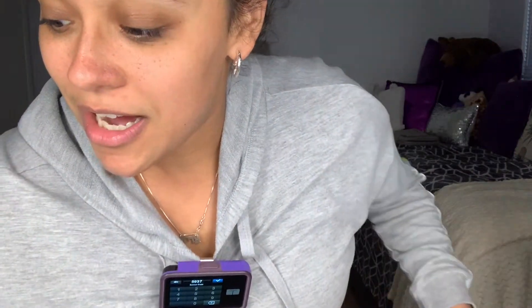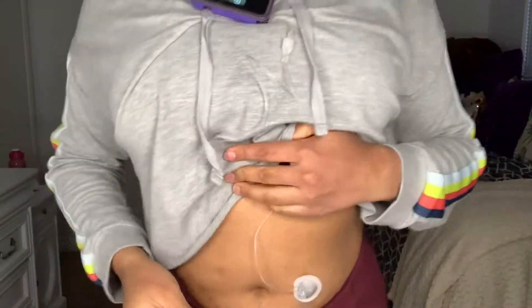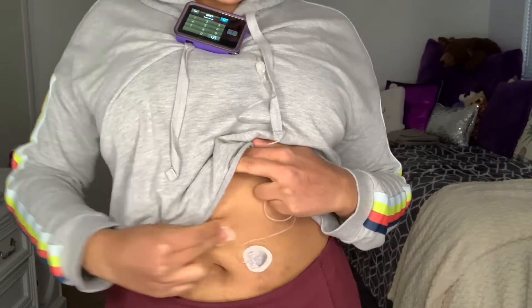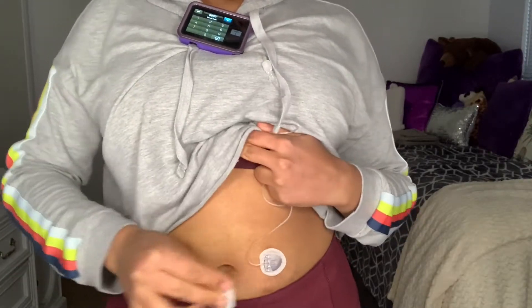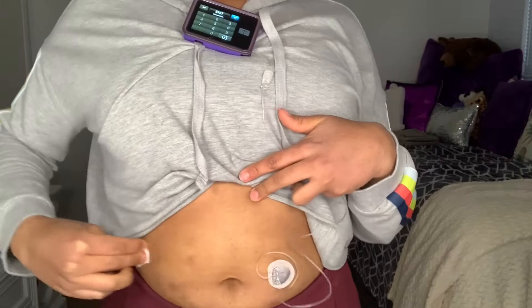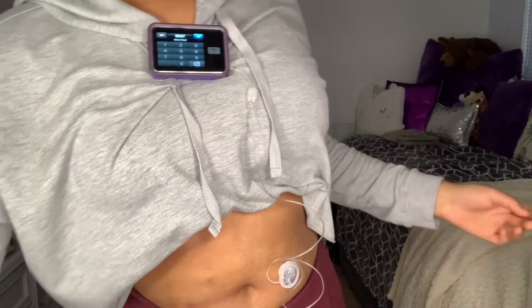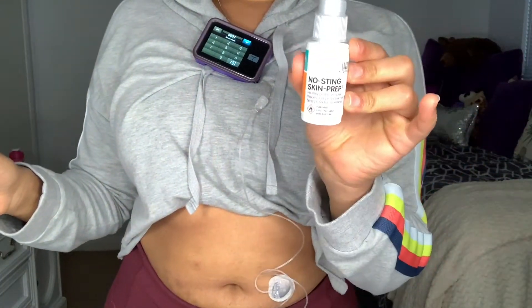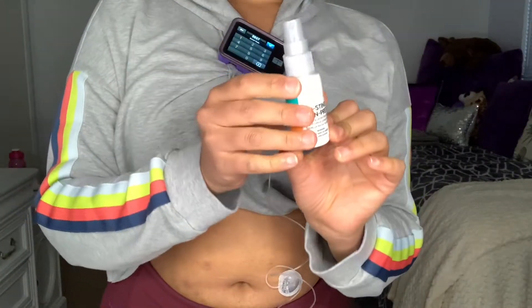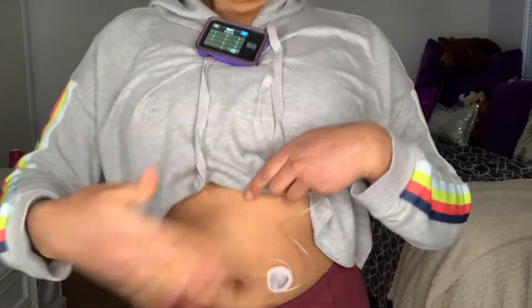Now I'm going to prep my skin. I'm going to take an alcohol swab and clean the area I want to put it on. Just let that dry off a little bit. I'm also going to spritz some of the adhesive skin prep right there and let that dry a little bit. While we're letting that dry, I'm going to clean my transmitter with a new alcohol swab.